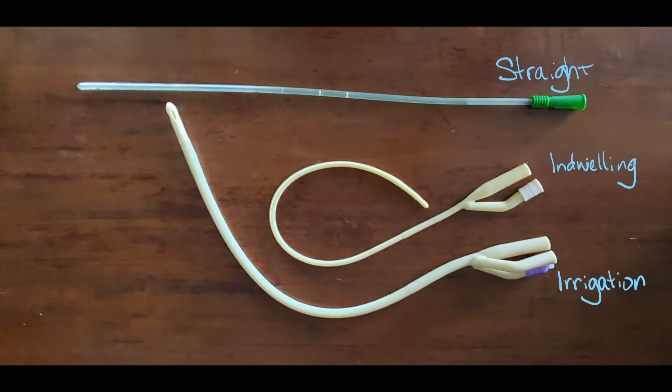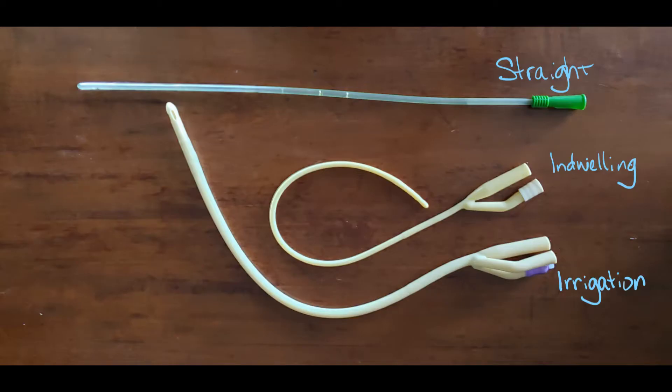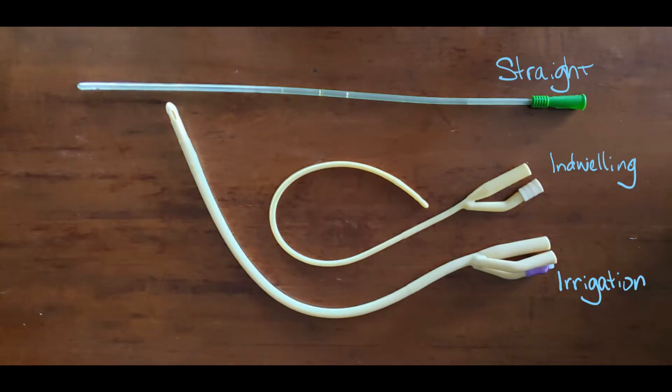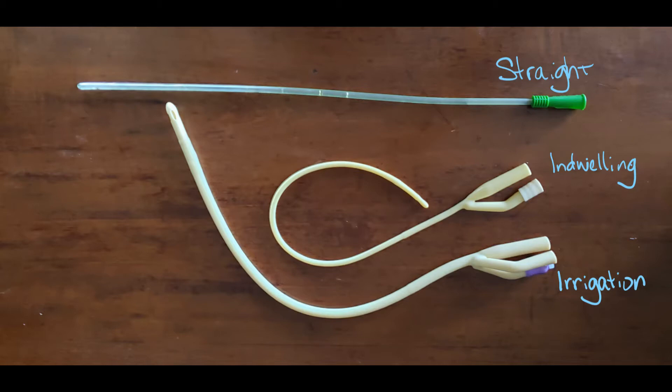Use a straight catheter if only a one-time urine specimen is needed, if the amount of residual urine is being measured, or if temporary decompression or emptying of the bladder is required. Use an indwelling or retention catheter, also known as a Foley catheter, if the bladder must remain empty, intermittent catheterization is contraindicated, or continuous urine measurement or collection is needed.